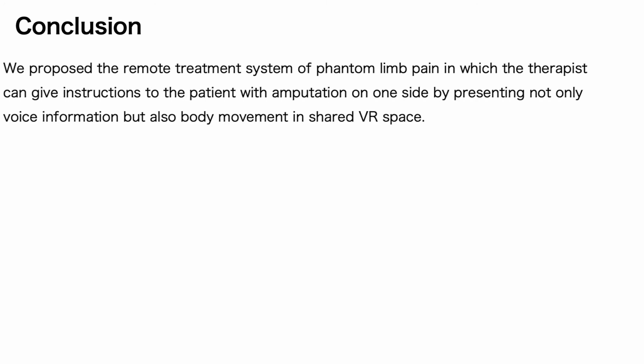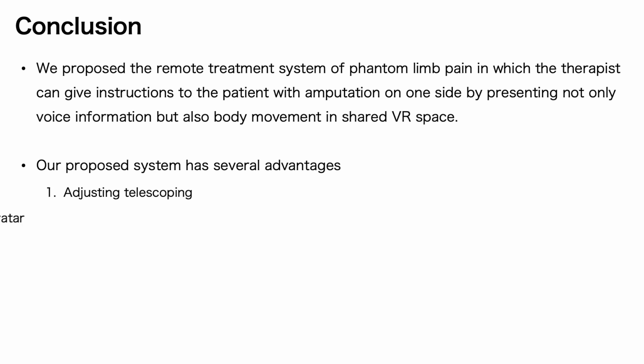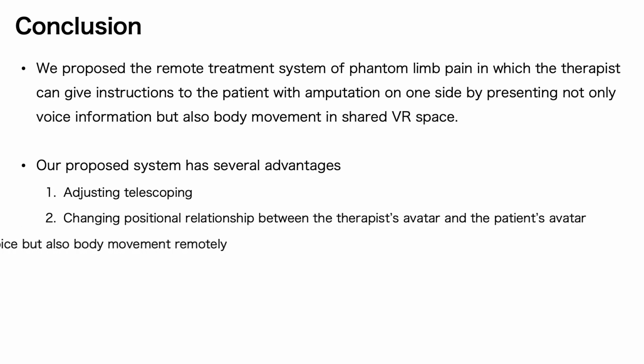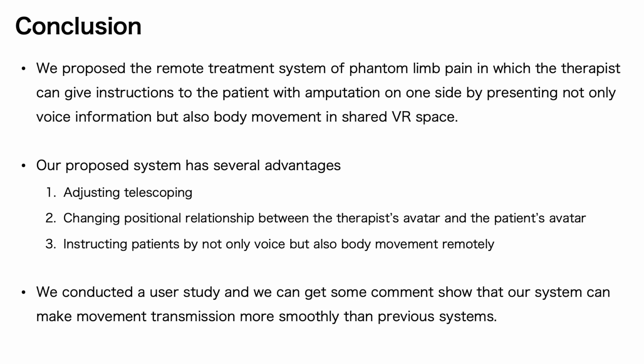Finally, I will conclude my presentation. We proposed the remote treatment system of phantom limb pain in which the therapist can give instructions to the patient with amputation on one side by presenting not only voice information but also body movement in shared VR space. Our proposed system has several advantages as below: adjusting telescoping, changing positional relationship, and instructing by using body movement remotely. And we conducted a user study and got some comments showing that our system can make movement transmission smoother than the previous system.